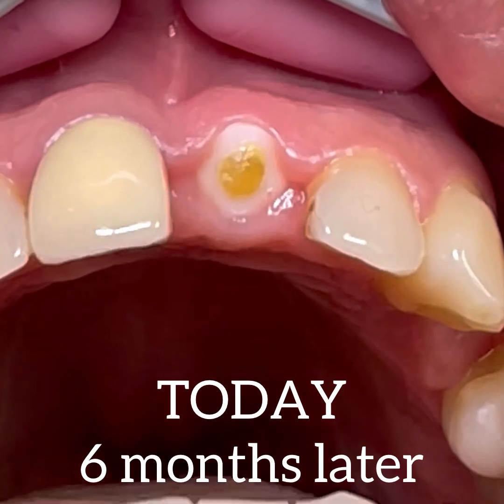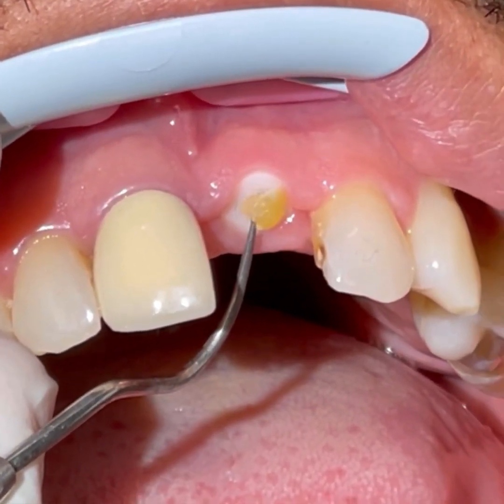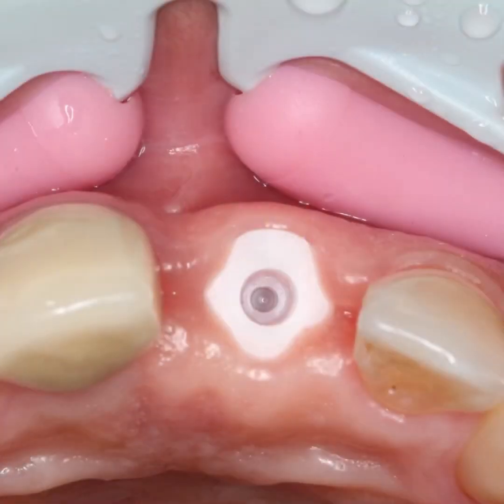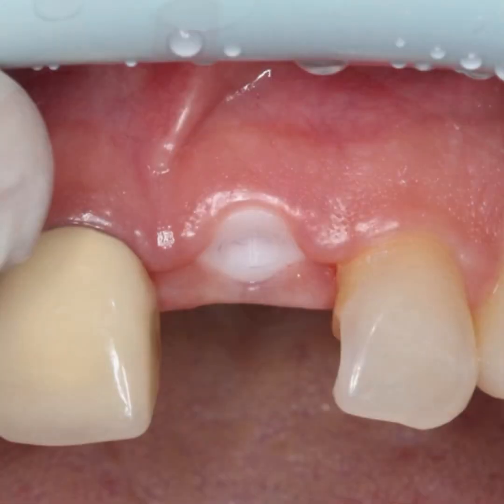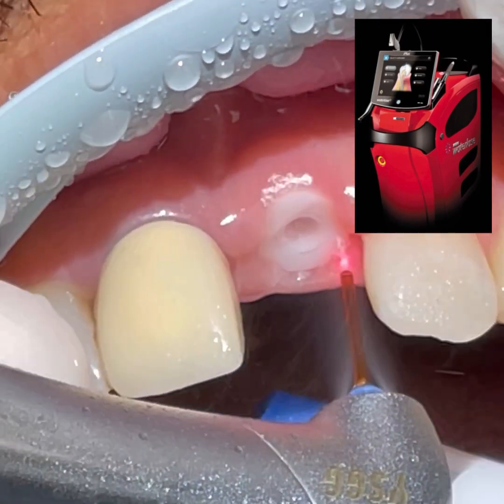After six months of healing, the patient comes back today and we notice how healthy the surrounding gums look. There is absolutely no inflammation because zirconia is very biocompatible. We also notice a healthy bulge of the buccal cortical architecture and how healthy the papillae look, with the natural stippling of the keratinized gingiva. At this stage we perform our stability test to confirm whether the implant has succeeded, which may also include a torque test.